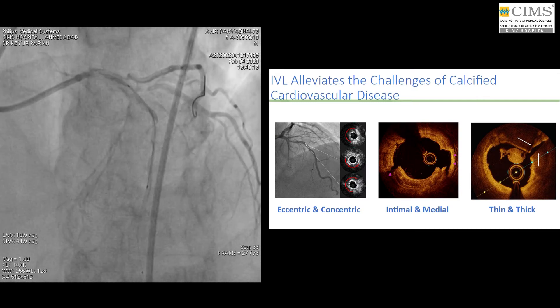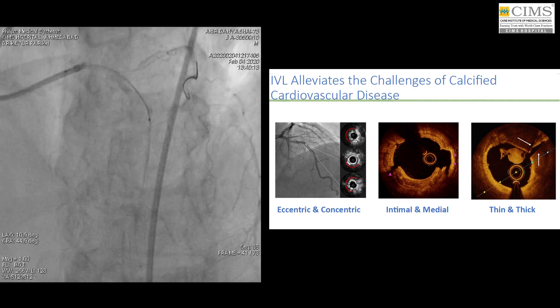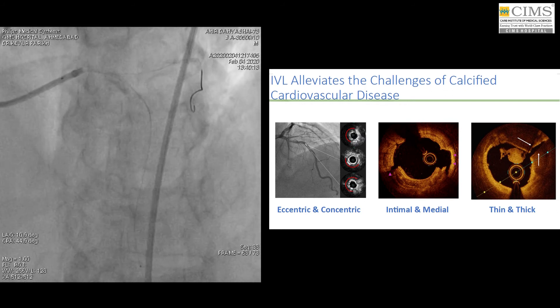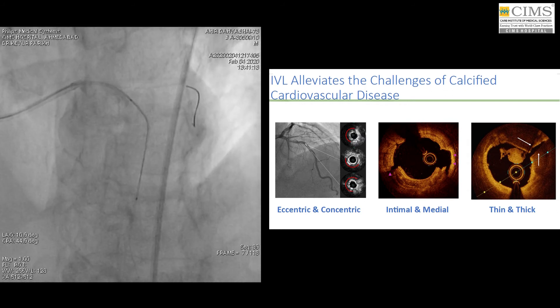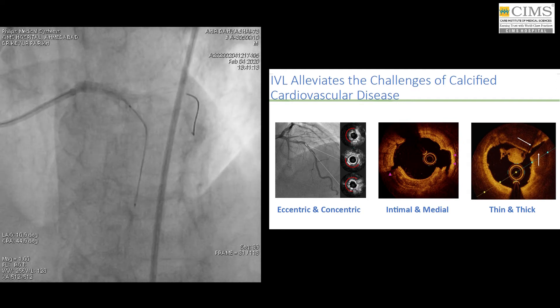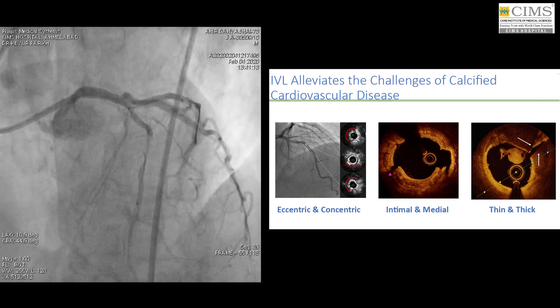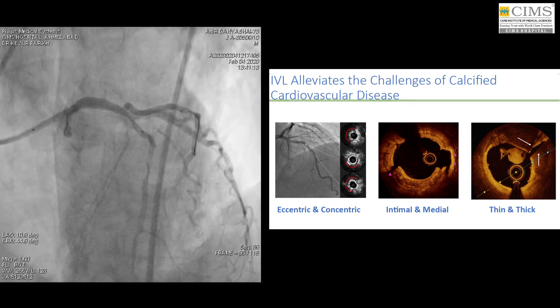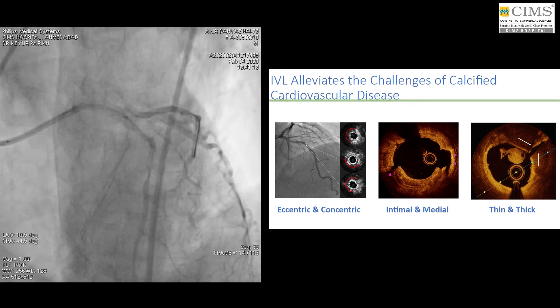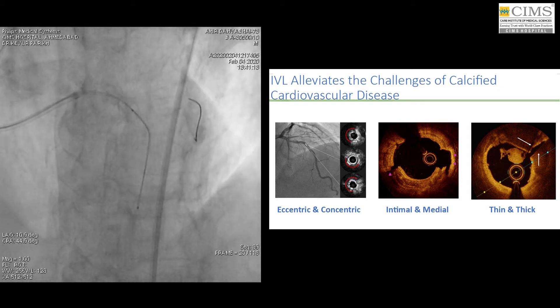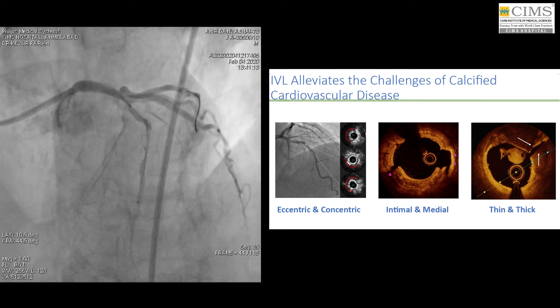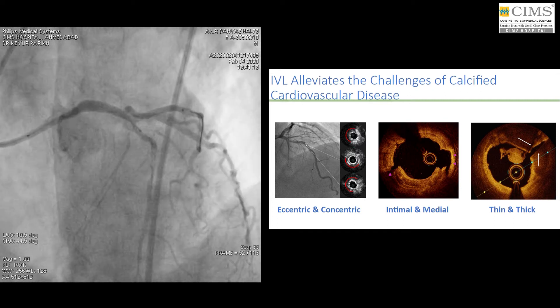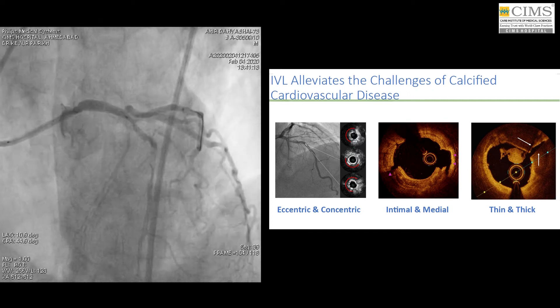IVL has done a fantastic job — it alleviates the challenges of calcified cardiovascular disease. As you can see in the OCT image on the right, IVL has cracked the calcium both superficially and deeply, and in both thin as well as thick calcium. Once it does that, the passage of other hardware — such as OCT, other balloons, and the stent — becomes very easy to track.